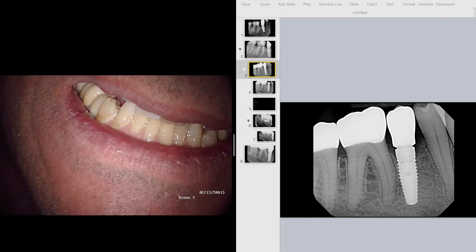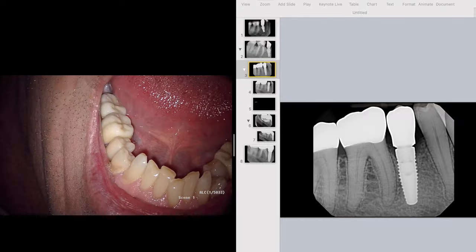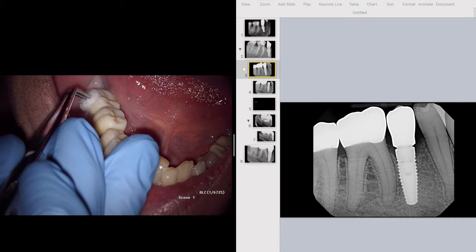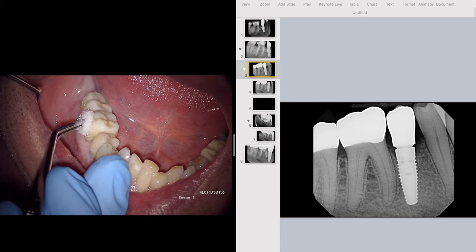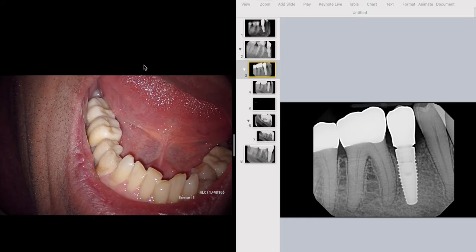We're going to finish the clinical exam with a cold test. We place cold endo-ice on a cotton pellet. What happened was he got a really slow, delayed response, but it did linger. I was wondering if the cotton pellet was warm. On the 4-7, the other zirconia crown also responded to cold, confirming we're getting thermal transmittance. We re-tested 4-6 and it took a really long time before we got a light response with a linger. So we went ahead and gave him local anesthesia.